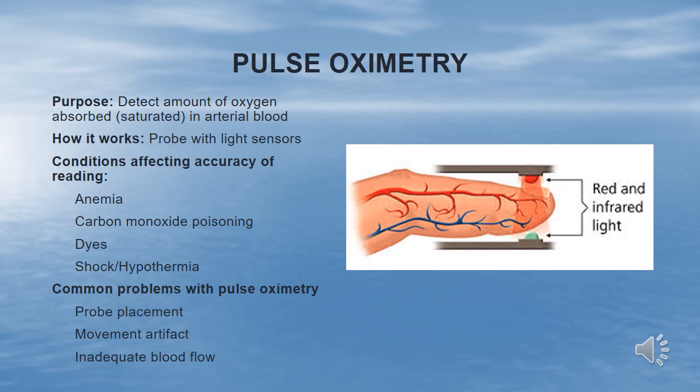For sedated patients, a good practice is to use the third or little finger for placement, as people tend to rub their eyes when waking up and can scratch the cornea. Certain nail polish colors or artificial nails can impede light detection. Blue, green, black, and some red or brown polish may need to be removed, or the sensor may need to be placed sideways on the finger.